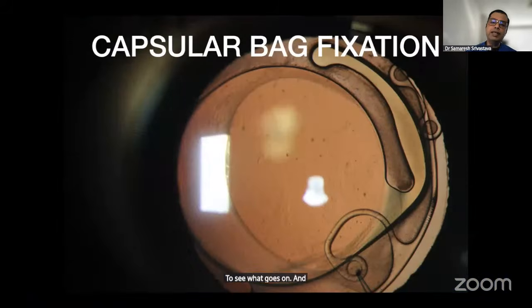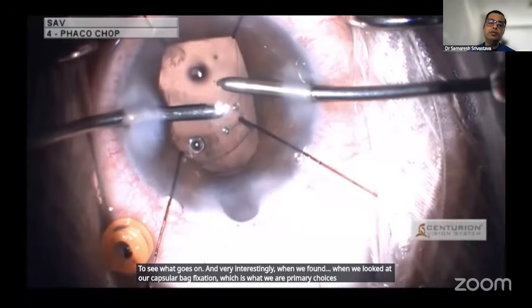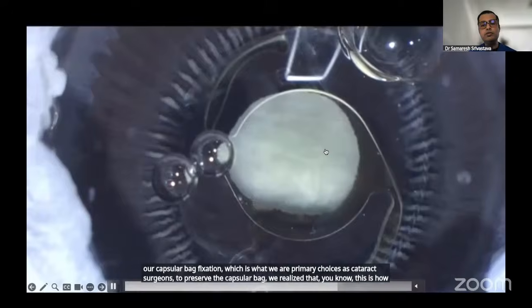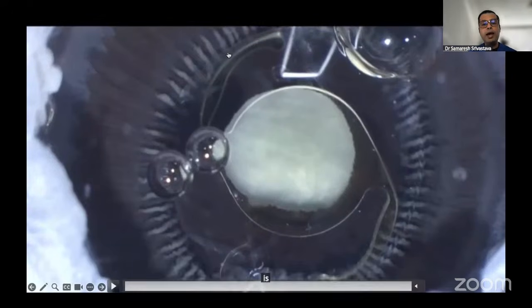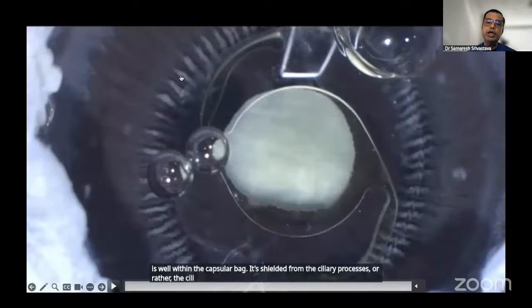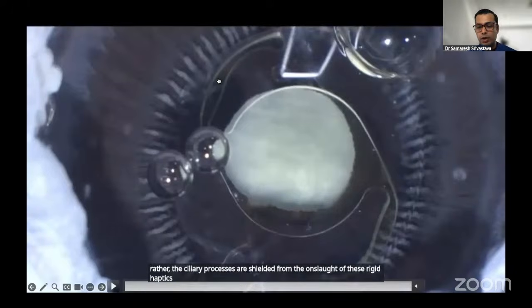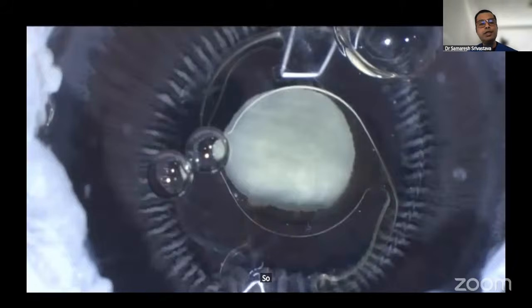And very interestingly, when we looked at our capsular bag fixation, which is what our primary choice is as cataract surgeons to preserve the capsular bag, we realized that this is how the eye looks from the inside, where whatever lens you put inside the eye is well within the capsular bag. It's shielded from the ciliary processes, or rather the ciliary processes are shielded from the onslaught of these rigid haptics and this PMMA material, which is not biologically truly compatible to the human eye. So compartmentalization always preserves the anatomy and physiology of the eye.